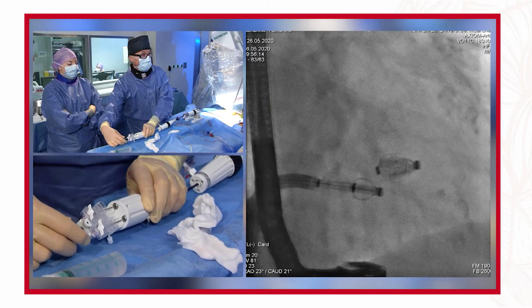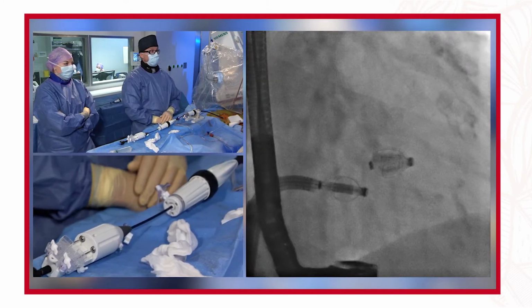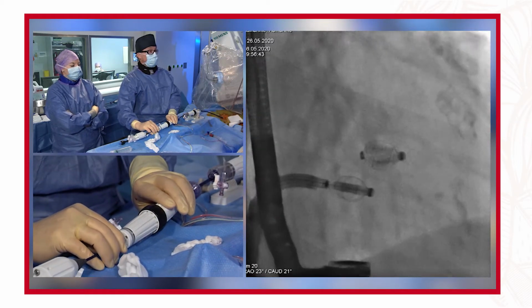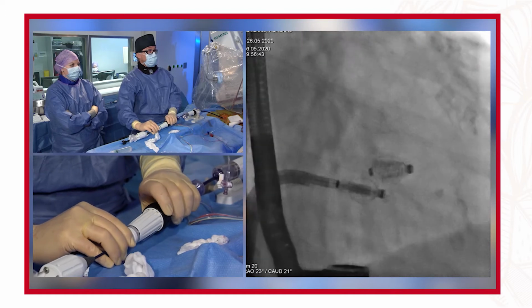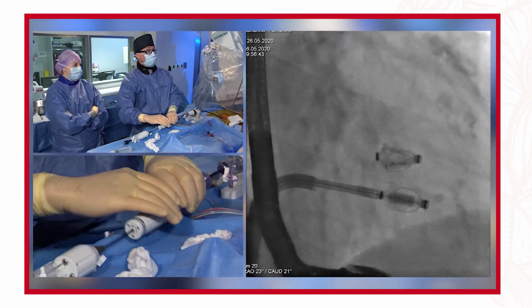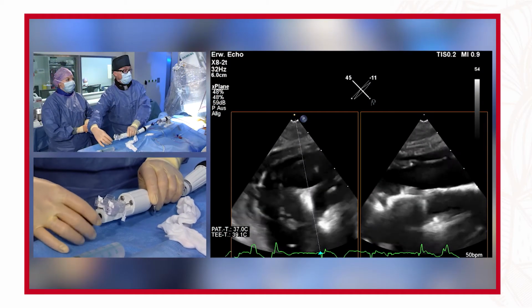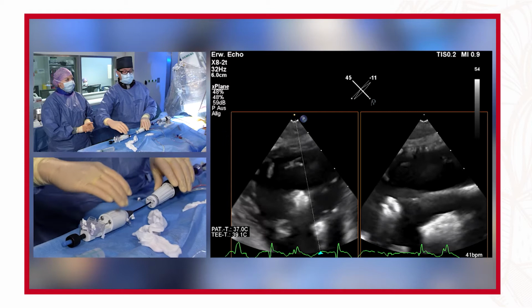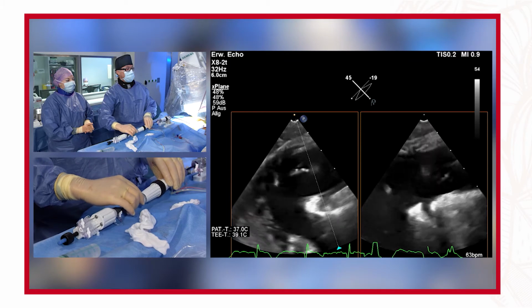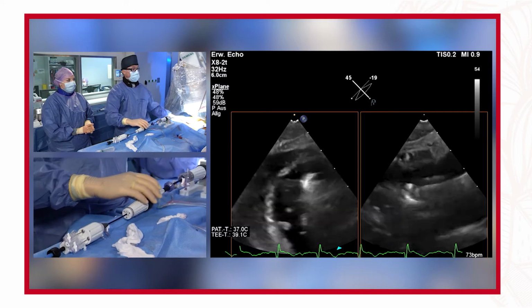We're orientating our fluoroscopy system so that we are perpendicular to this system, so that we always have a fluoroscopic feedback if our system turns while we move now into the right ventricle. We just want to be as close as possible just beneath the first PASCAL system, as you see here. This is being performed by fluoroscopy as well as echocardiographic control. You see in this transgastric view that we're just beneath the leaflets of the tricuspid valve in this posterior location.